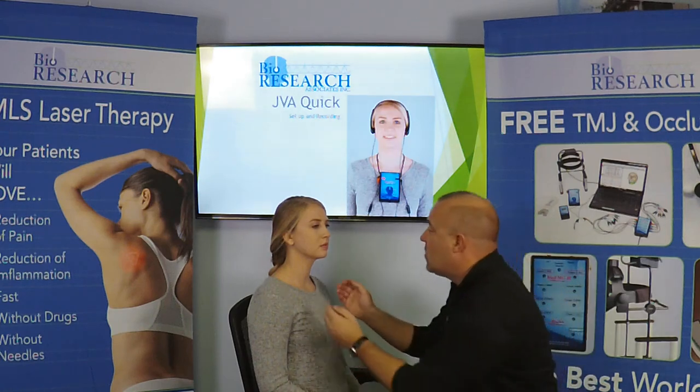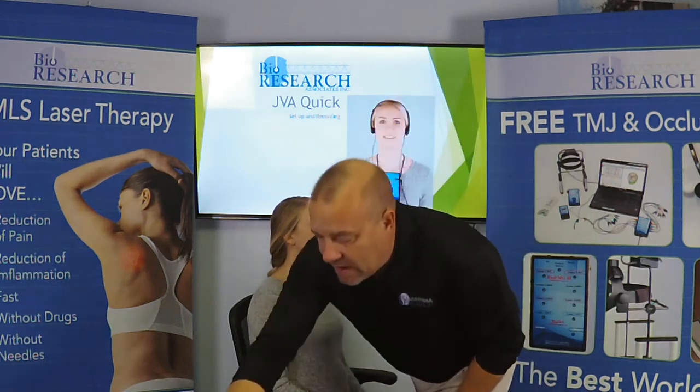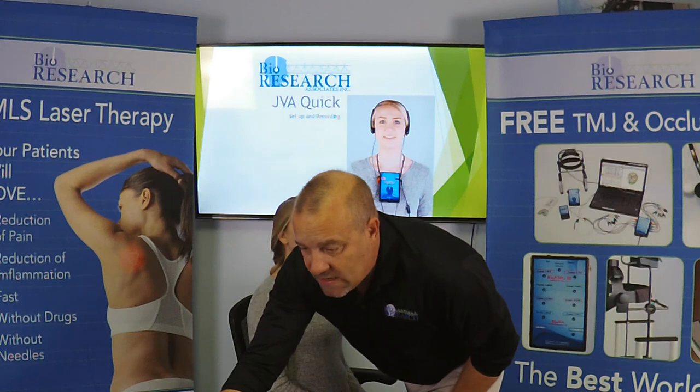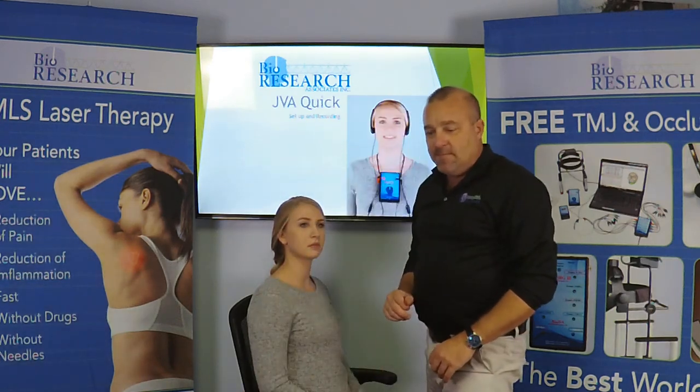The other question that the computer will ask when we do protrusion is, what is the direction of the protrusion? Do they come straight out? Do they come out and to the right? Or do they come out and to the left? So go ahead and just protrude, stick your jaw out like a bulldog. She comes out straight at me, so I will simply click straight. Now, when we click OK, joint vibration analysis will begin recording.